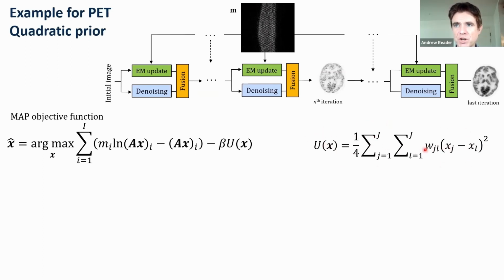Because the point is, the image X that maximizes this log posterior needs to have this penalty applied, where we're looking at differences between the pixels in the estimate that we're about to calculate. This turns out to be a very difficult optimization to perform, even though it's only a quadratic on a difference image. So when we go to the Poisson case compared to the least squares case, optimization generally becomes a lot tougher, as I hope you're beginning to realize.